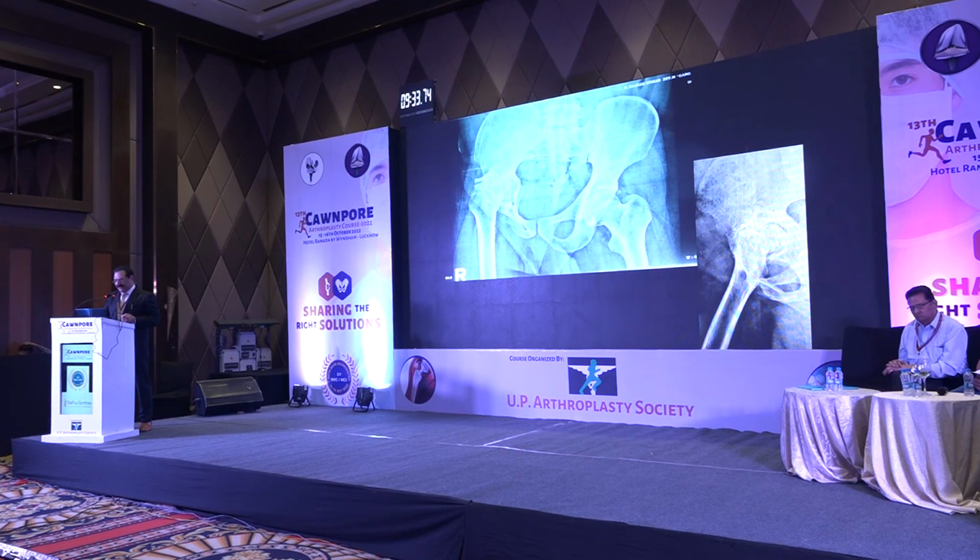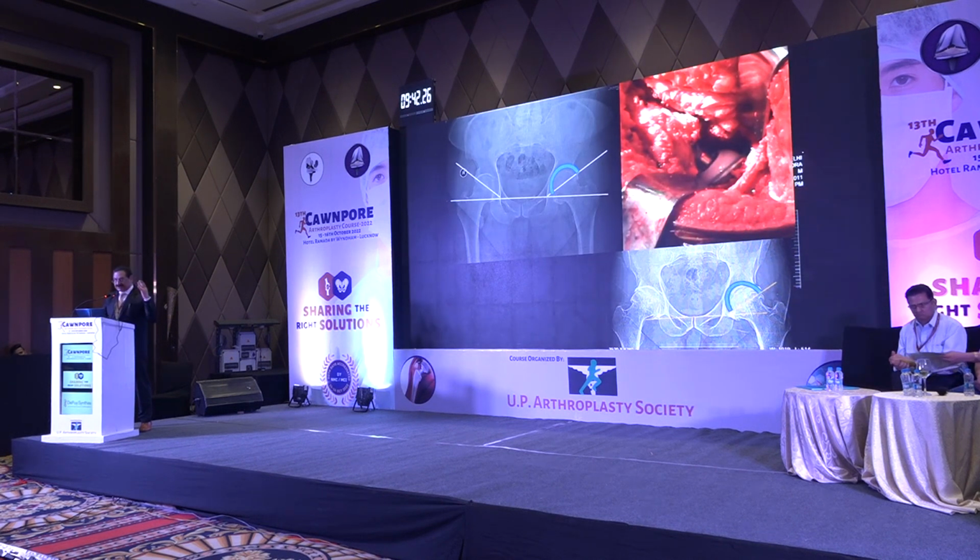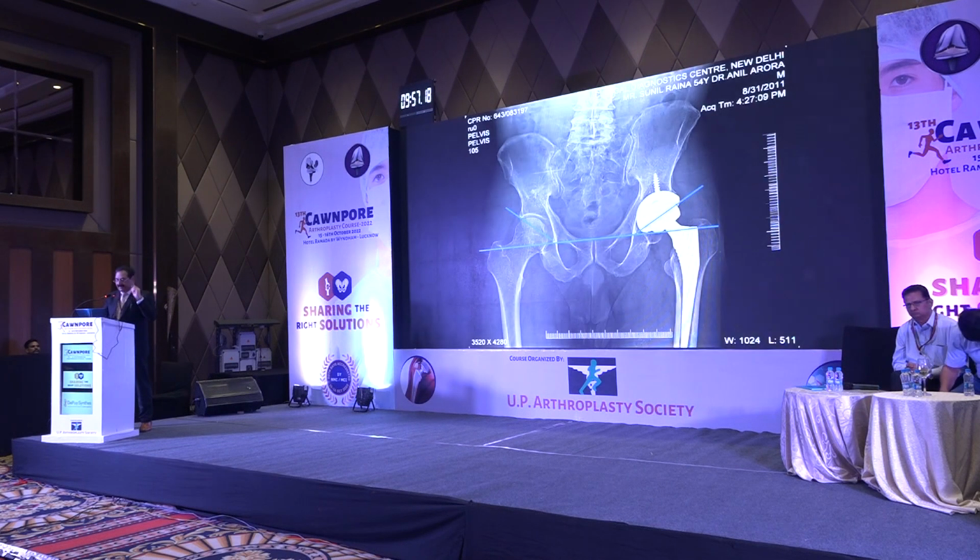This was a post-septic case; we wanted a mobile, painless, stable hip, and we did a hip replacement on this patient, who is doing well. Whenever you see a preoperative X-ray and you know how much you want to close the cup, mentally template how much of the cup will look uncovered intraoperatively. You can reproduce the same thing on the table, and then you will have a satisfying X-ray.